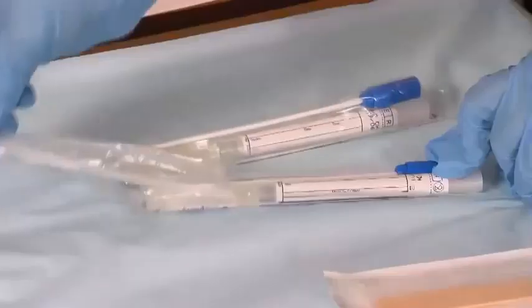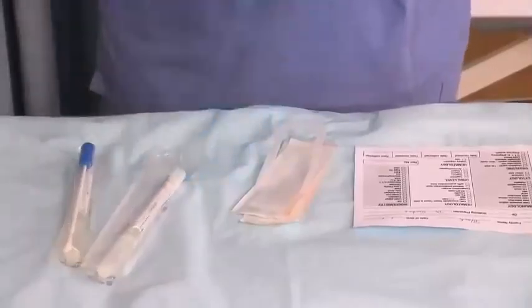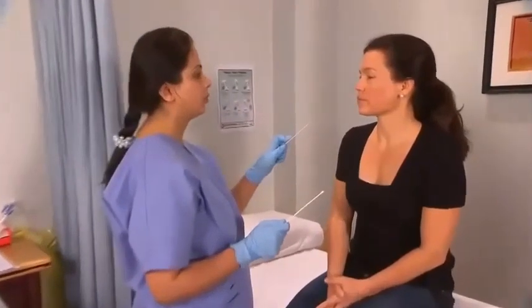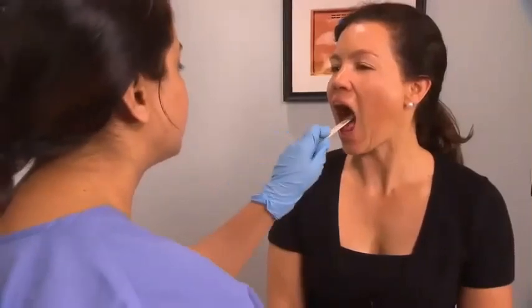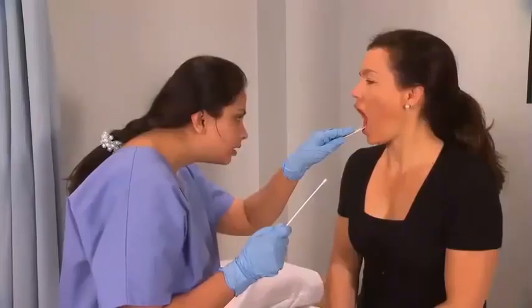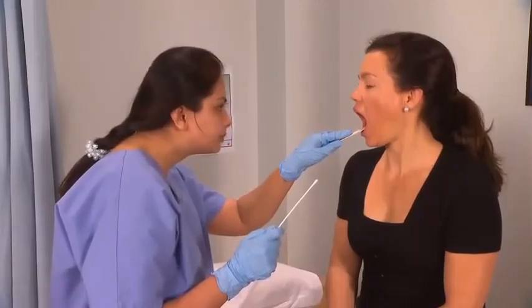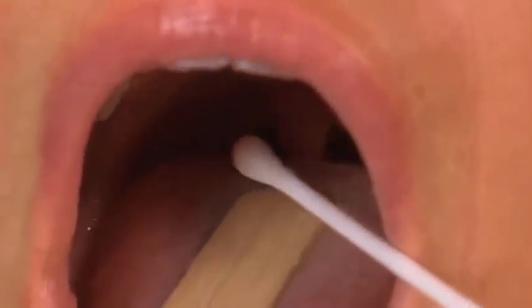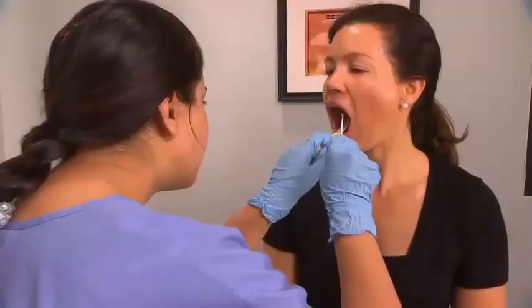Open the sterile swab packaging carefully. Pick up the tongue depressor and the sterile swab. Ask the patient to open their mouth and say, "Ah." Place the tongue depressor on the tongue and depress. Inform the patient that you are about to swab them and insert the swab into the mouth towards the back of the throat. Take care not to touch other structures.